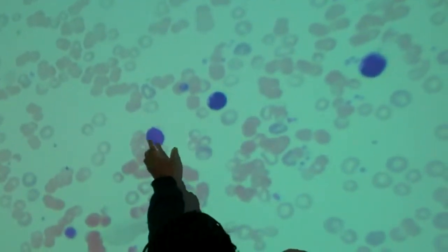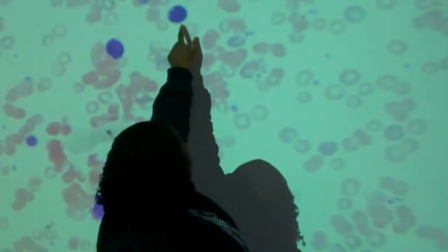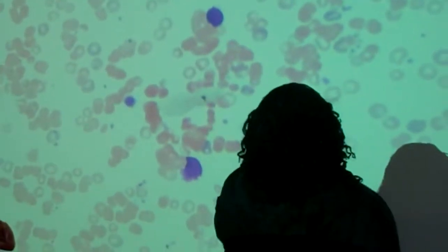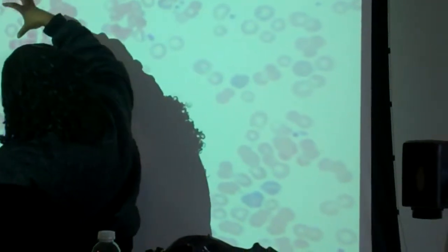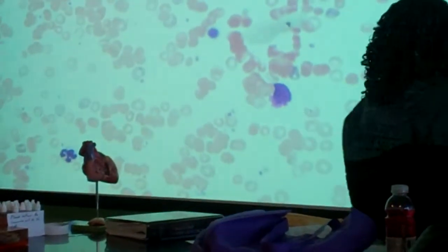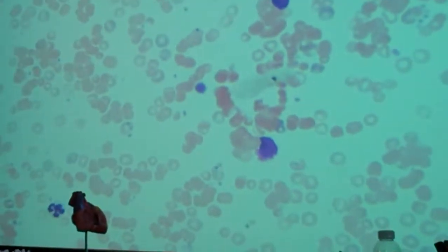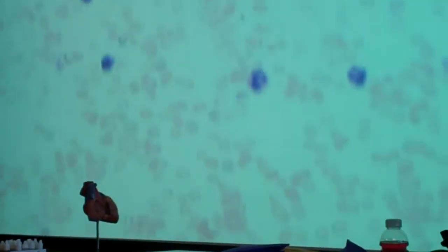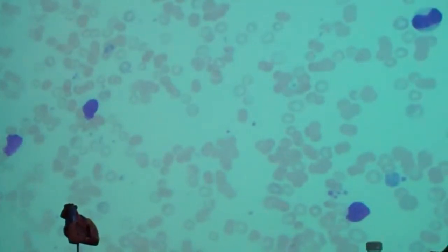I thought this is another one, but if you see this, this will confuse you. You may think this is a lymphocyte. Okay, and that one too. But the clear ones are the ones where you clearly see that it's a red blood cell and they have a dark spot inside of it. Some may look like wreaths, some may look like just red blood cells that are spotted, and some may actually look like a nucleus.